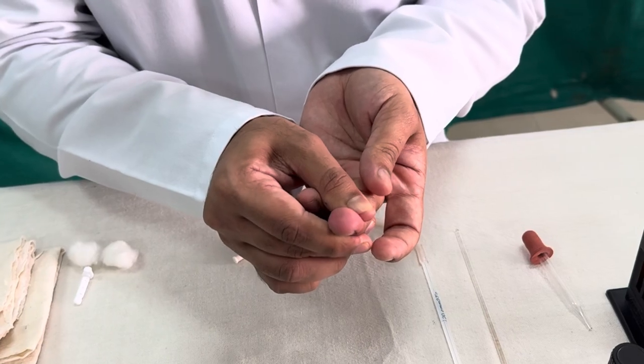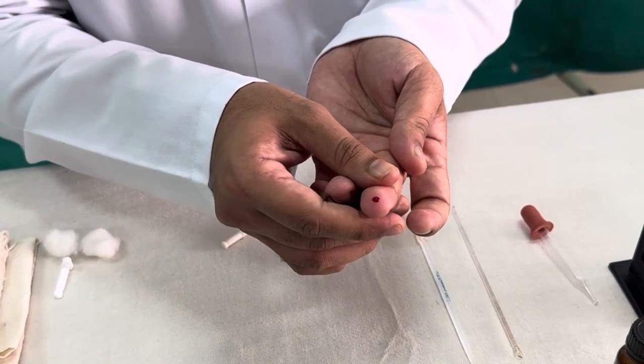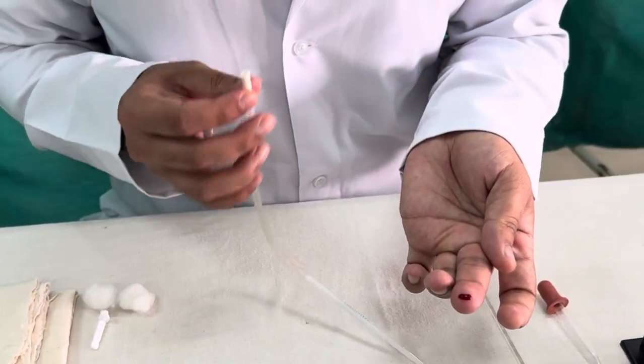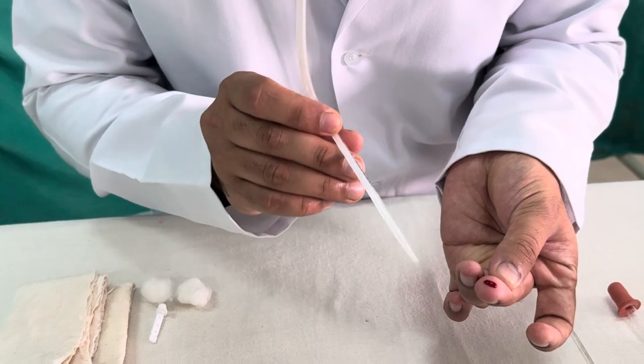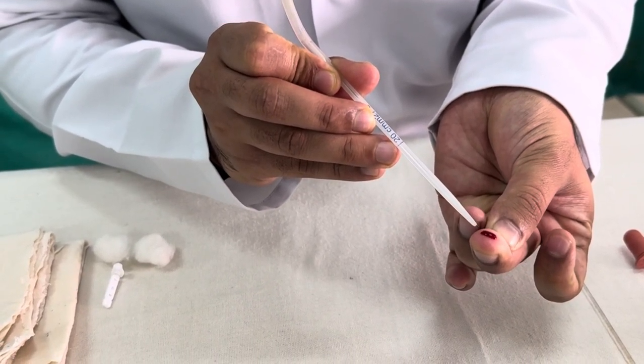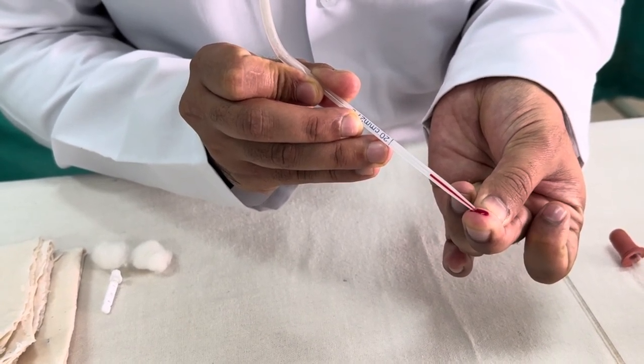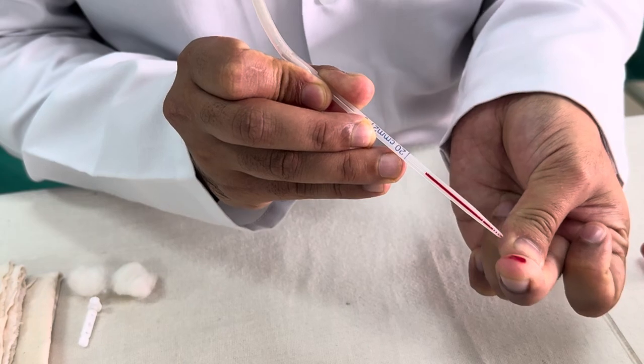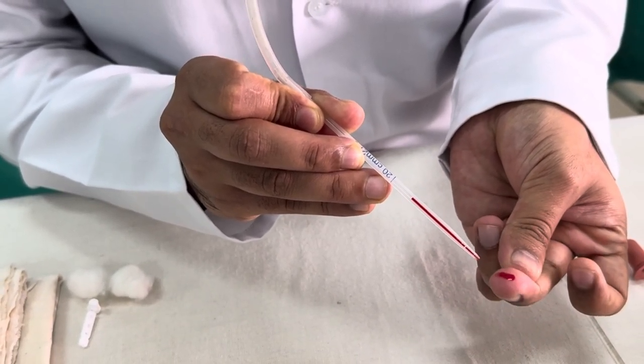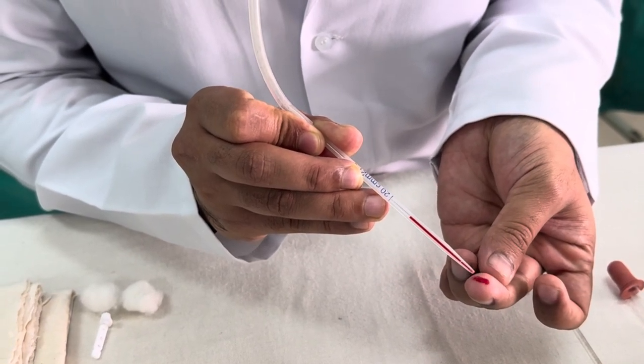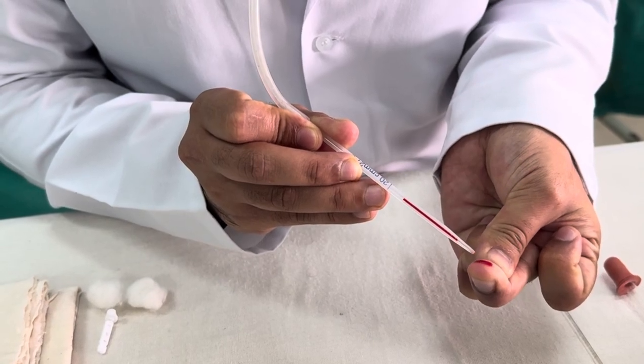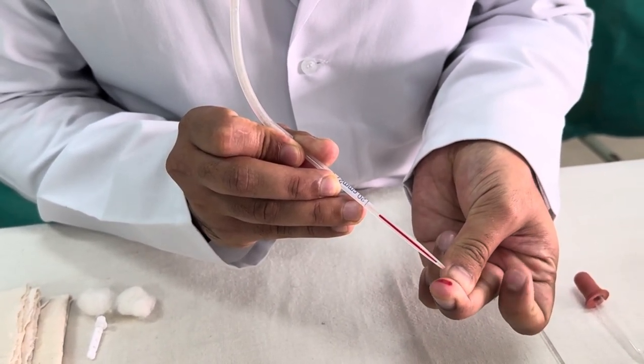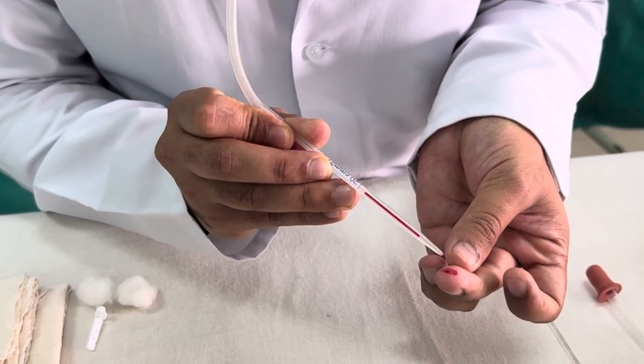Then wait for some time when a big drop - actually you should not squeeze it, it should come automatically - a big drop will appear at the fingertip. When enough big drop is there, then just place the pipette mouthpiece in the mouth and the other end you should just bring near the drop of blood and try to suck it. So with the capillary action also it will automatically, the blood is taken up. See how it is taken up. Then you have to collect the blood up to 20 microliter mark, 20 microliter or cubic millimeter. So make sure that there should be no air bubbles in between this. If you have enough blood drop then you will get a good quantity of the blood.